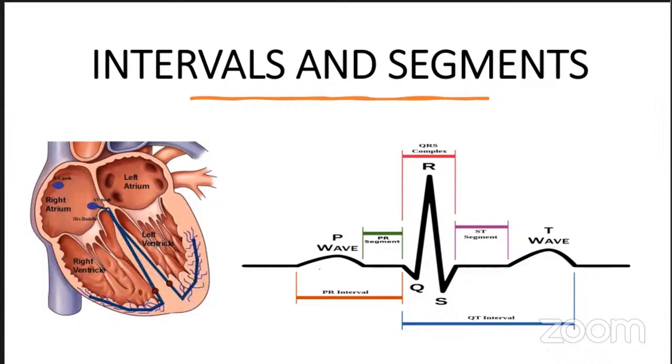Okay, so after ventricular depolarization or ventricular contraction, we're going to have this time interval when the ventricles have finished depolarizing. So now the ECG is not going to detect current moving within the ventricles, because it has all transformed from negative to positive. So all of the myocytes within the ventricles are fully depolarized. So there's no current moving in the ventricles. And as a result, the needle is going to go back to the isoelectric line.